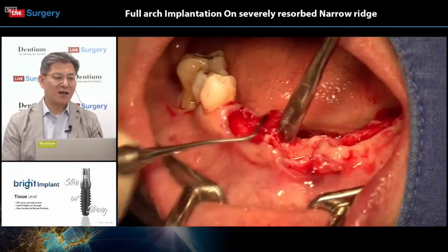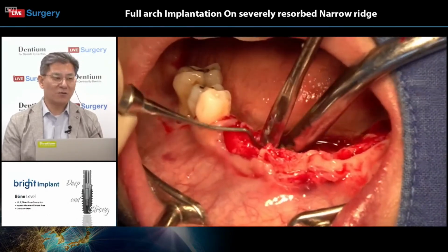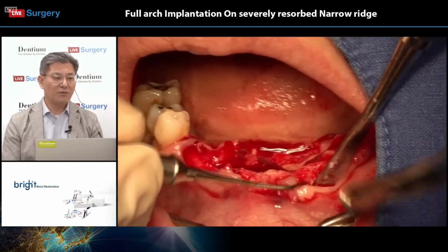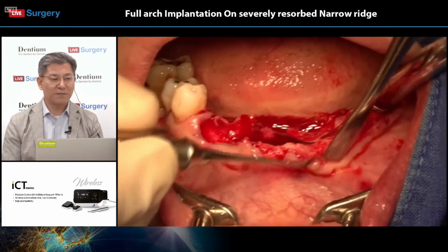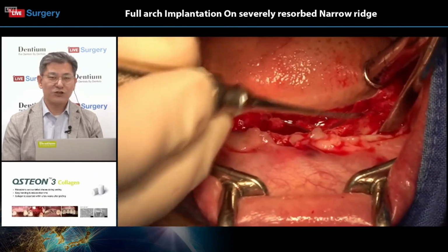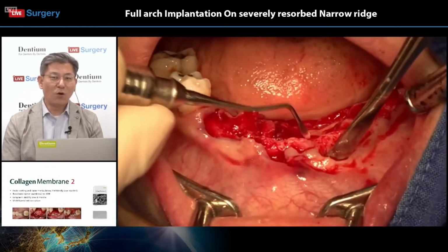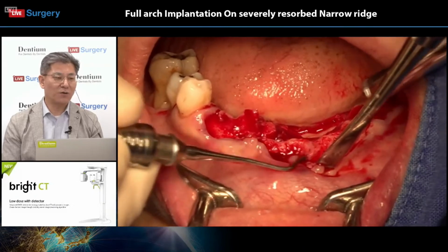For me, I loved using this black round bar. The shape of this round bar, the spear type, means a higher contact surface to bone or other tissues, and a higher contact surface means it is more efficient when we use this kind of black round bar.